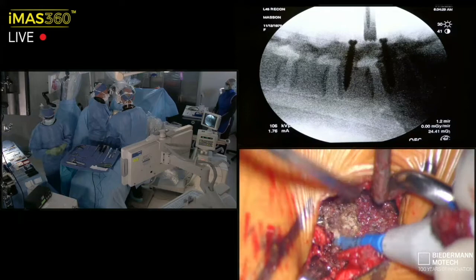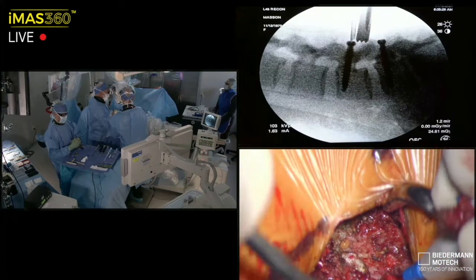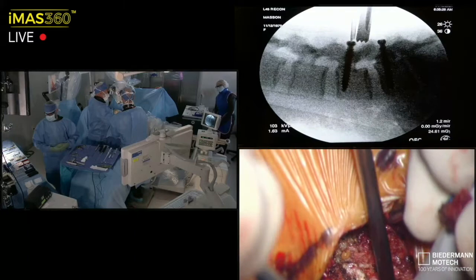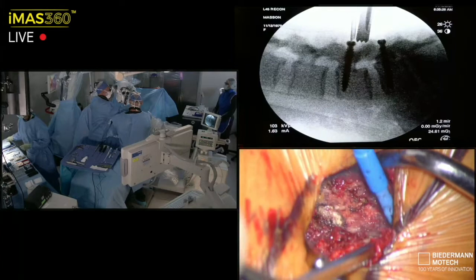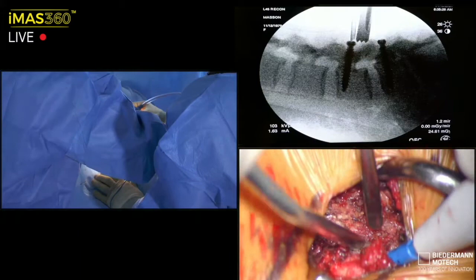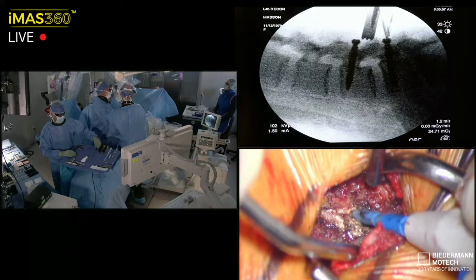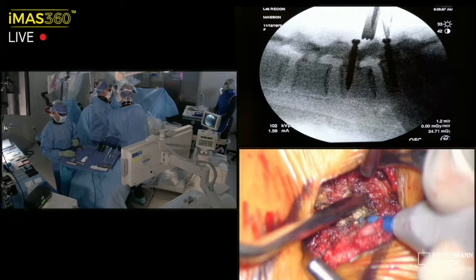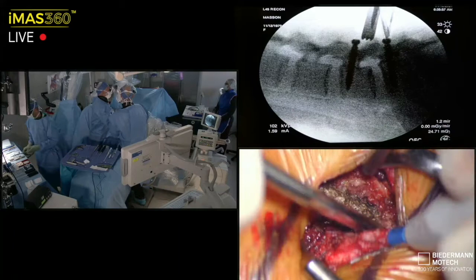So in this case, we're L4-5 left, interpedicular space. We've got the high L4 screw confirmed fluoroscopically there. We'll go down here, and that's going to be the low screw right there. So there's the L5 screw left right there. Pretty sure that's visible within the field. I'm approaching my laminotomy defect medially from lateral to medial. So I'm going to keep assessing that. I still have bone here. So this is a big cleft within the facet itself. So again, screw, screw, midline.